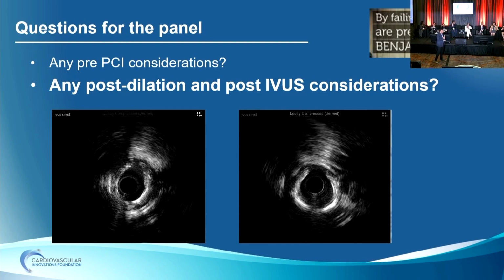How long an area of calcification was it on the IVUS? I'd probably say like 10 to 15 millimeters, so just that focal area. Because if it's 10 to 15, to that degree of circumferential calcification, I would think you'd want to do some sort of modification besides balloon. I think if you were able to get your balloon through, in my opinion, I would use an IVL because it looks like you're able to expand it, and it's relatively focal.